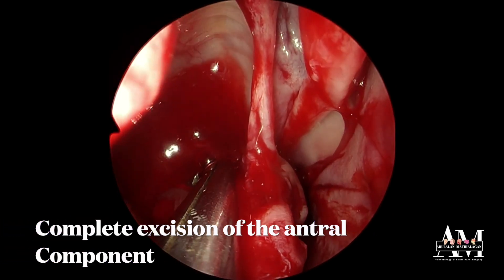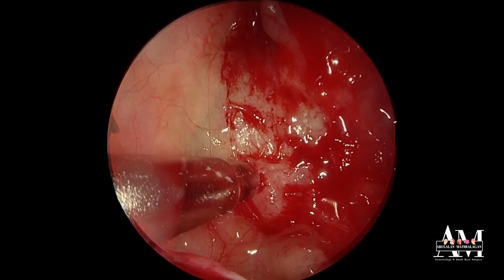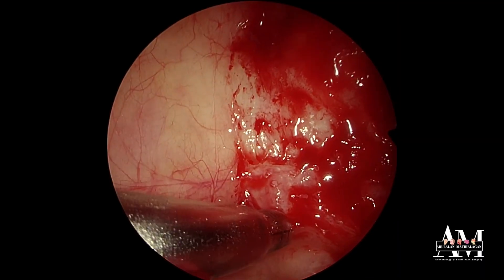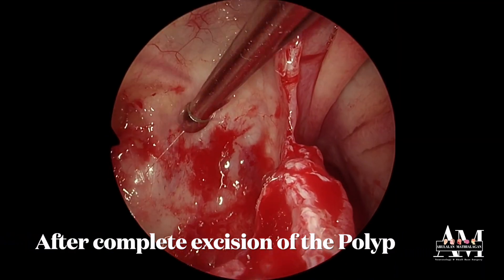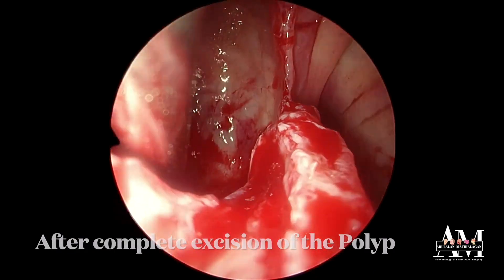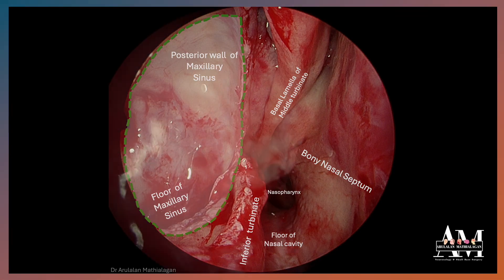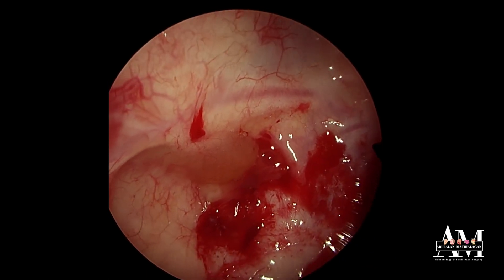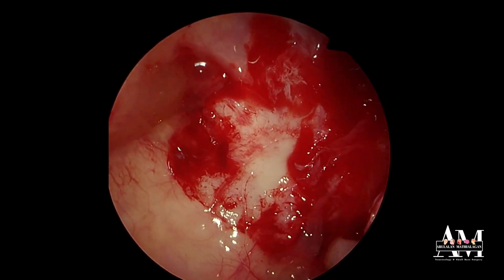The antral part is clearly excised and the remnant of the mucosa is debrided using an angled blade. This is the completion of the excision. This is the wide middle meatal antrostomy. Again visualizing with a 70-degree scope, we can clearly visualize the entire maxillary antrum and it has been completely removed. We can clearly see the floor as well.